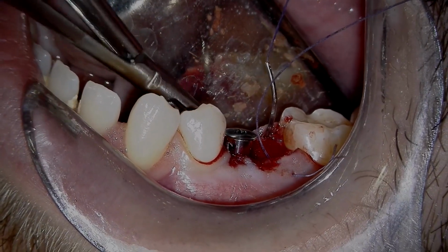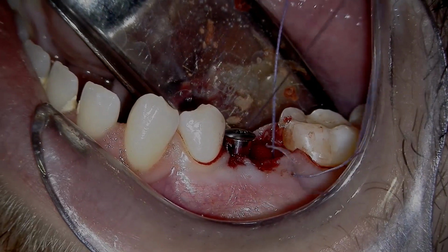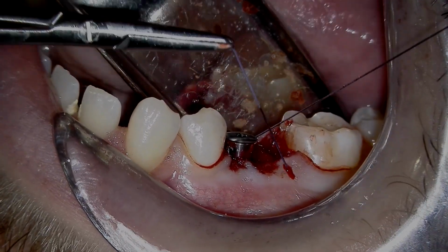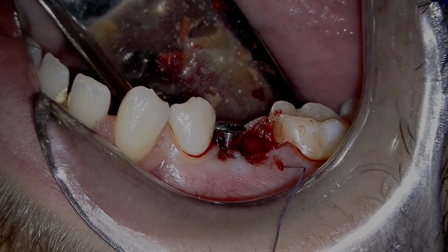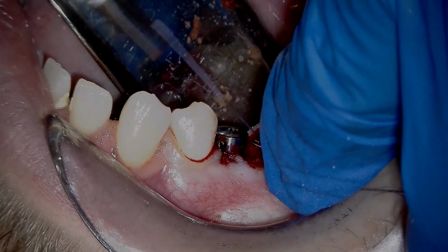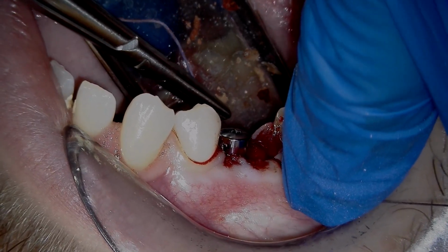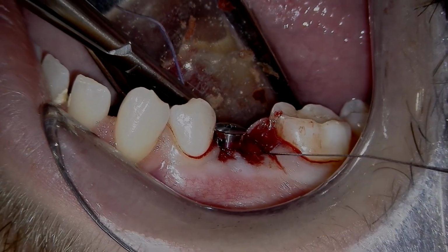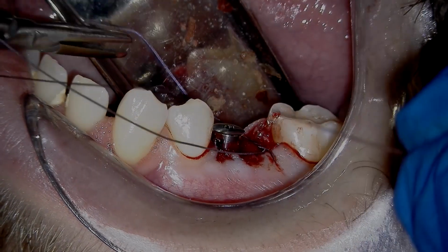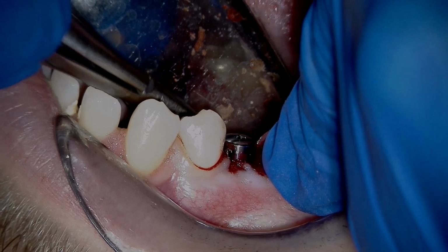If I come down low to the crest of the bone there, it tends to pull the membrane down a little bit better. So I'm going to feel the bone with my needle, pull it through. I'm tugging both ends just to kind of pull it down, and then a basic interrupted knot. And again, I like it to lay flat, not ball up, so pay attention to how you tighten if you're pulling the strands in the right direction. A couple more turns here. Tighten this into place.